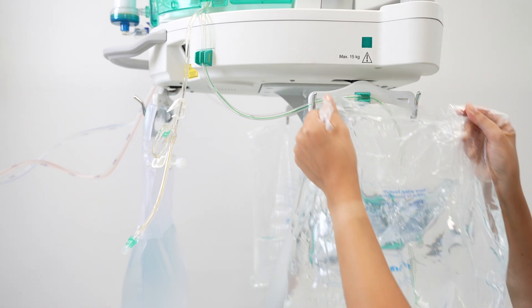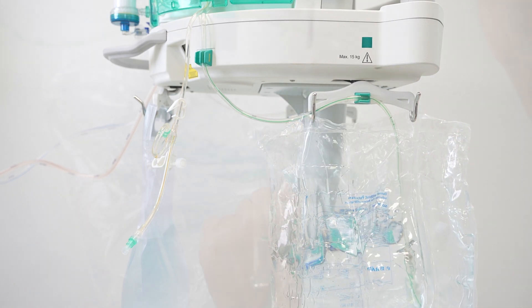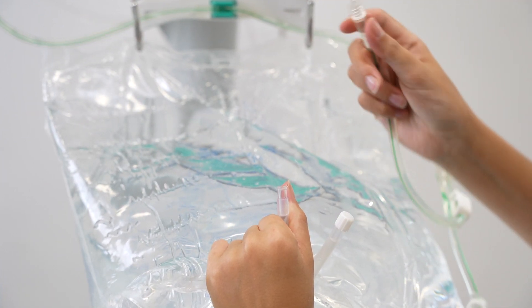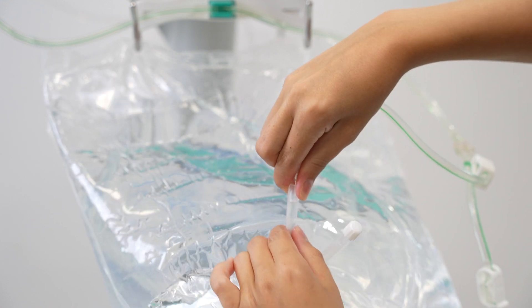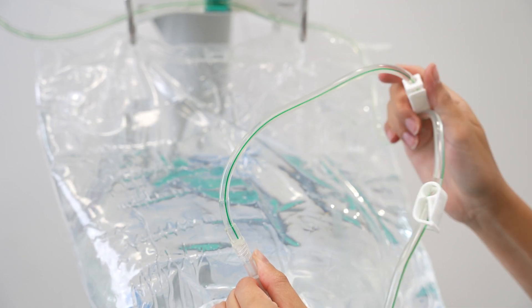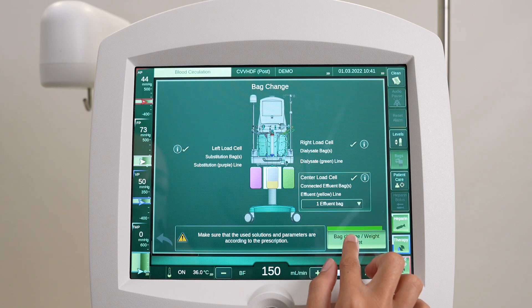Hang one or two new dialysate bags on the load cell. Remove the cap and connect the dialysate line to the dialysate bag. Break the frangible pin in the bag outlet and open the clamp on the dialysate line. Press the bag change weight reset button.